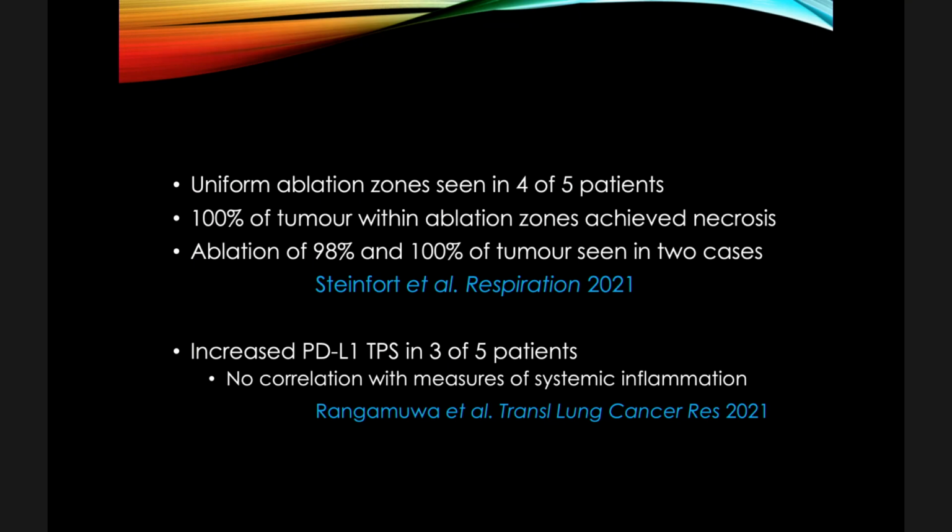And the main issue here was that this area of tumour was positioned outside the ablation zone. This suggested to us that perhaps increased number of ablation doses during the procedure would potentially improve the success rate of the procedure. We've published these results earlier this year in the Respiration Journal.